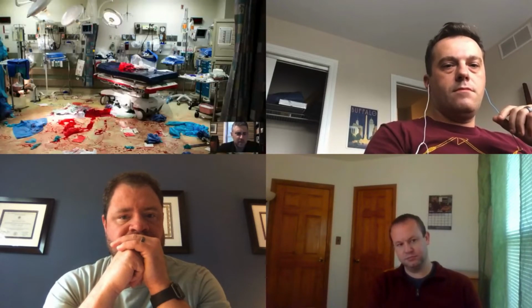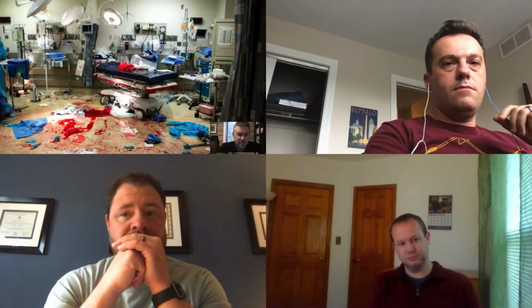So basically, let's talk a little about trauma. We've been in that trauma resus mode, like I said. We're going to talk about the FAST exam, draw it all together with these unique cases, and tease out some of the unique things that you can see when you do the FAST exam. So this is what we're typically accustomed to with a nice trauma resuscitation.